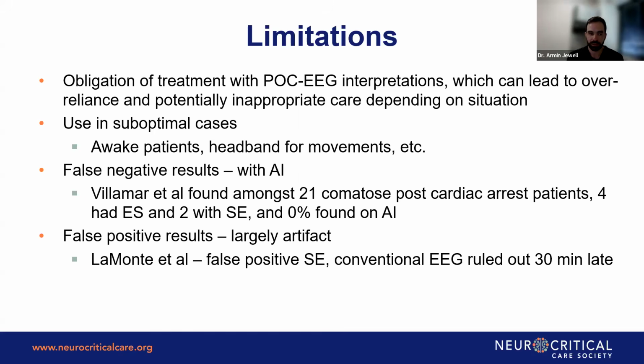And then false positive results as well. Largely, again, these are related to artifact, so there were some times that it was tough to tell. In one study, there was a false positive status epilepticus, which led to earlier treatment than was necessary. Conventional EEG was then eventually placed and ruled it out, and they were able to de-escalate treatment at that point. So these are, again, some limitations for the point of care EEG.